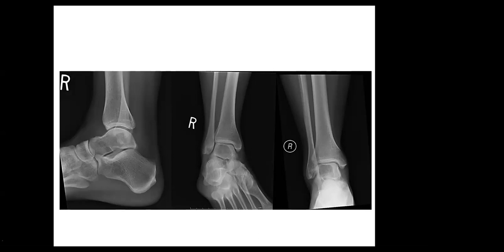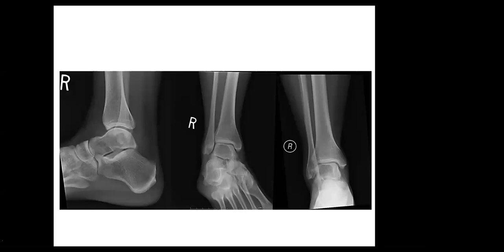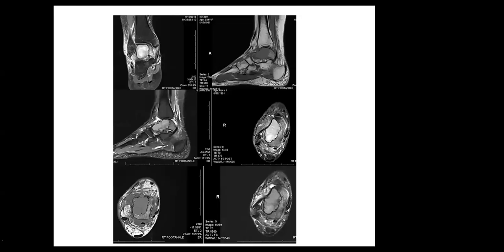Yes. So before we move on, are you going to maybe be more descriptive, or okay, let's show you the MRI. Yes, MRI of the ankle joint.